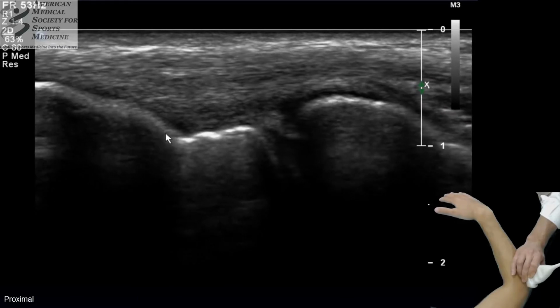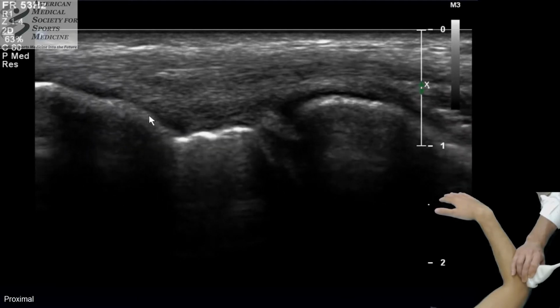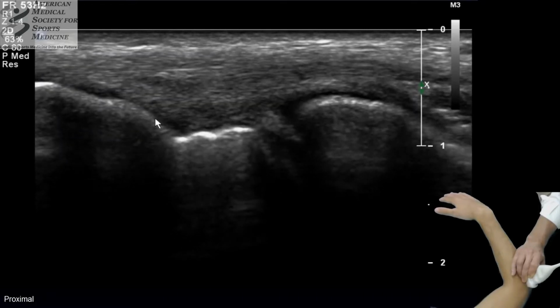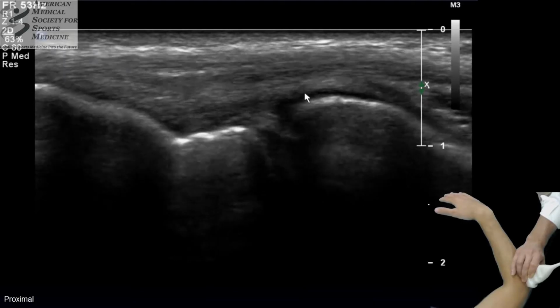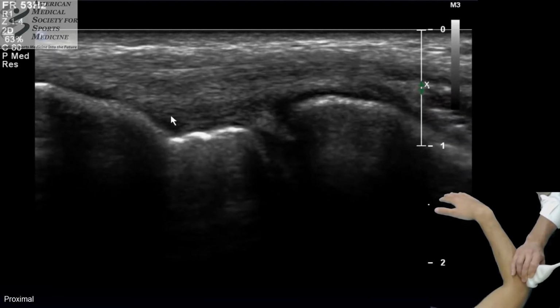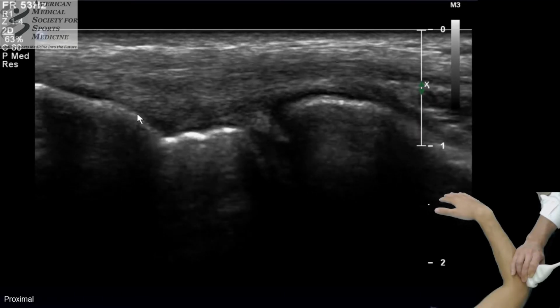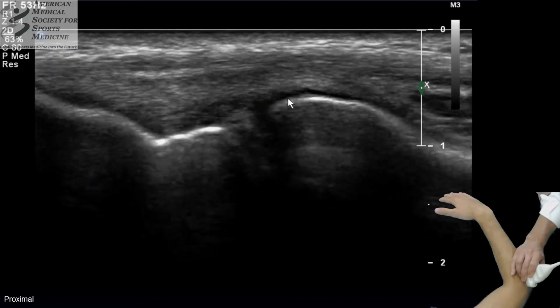essentially the deep 50% of the common extensor tendon origin region, or this lateral epicondylar region, is going to be radial collateral ligament origin. You can see some fibers here blending with this annular ligament here. So this is radial collateral ligament coming off of this area. It's either the deep 50% or deep 30%. So 30 to 50% is going to be your radial collateral ligament.